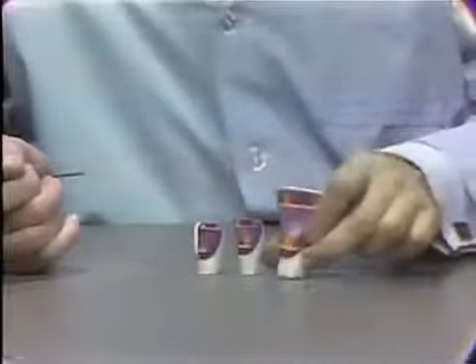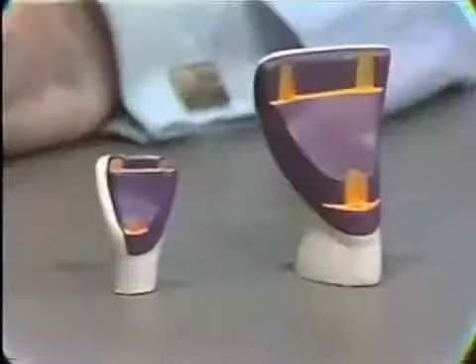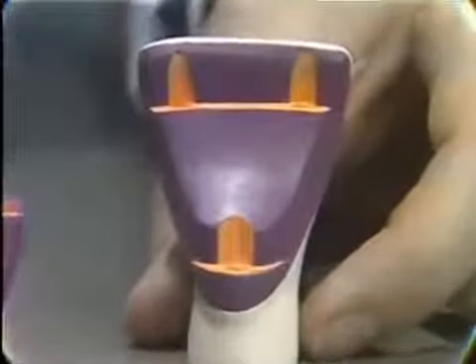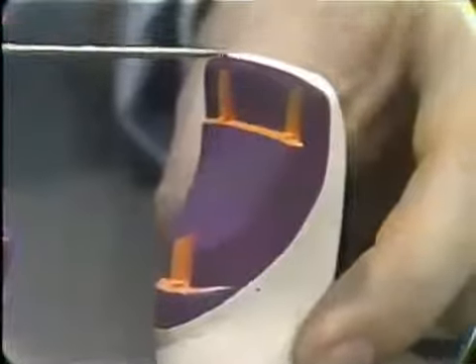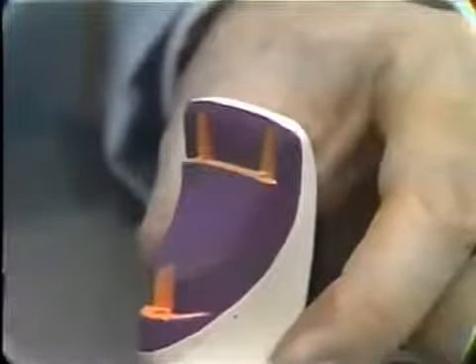The pin ledge preparation can be used on mandibular incisors with equal facility, and leads to preparations of this type, which you see here. Here's a bilateral pin ledge preparation on a mandibular incisor. Slightly different shape because of the slightly different shape of the mandibular incisor. The degree of protection of the incisal here can be modified from this one, which is minimal, to one in which it comes as far over the incisal as you may wish in any particular case.